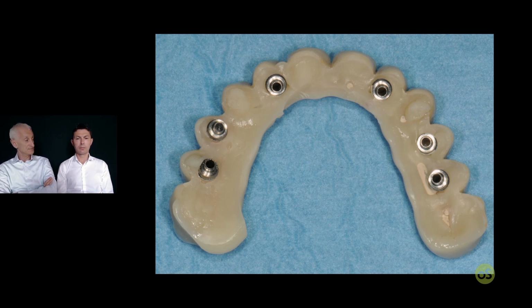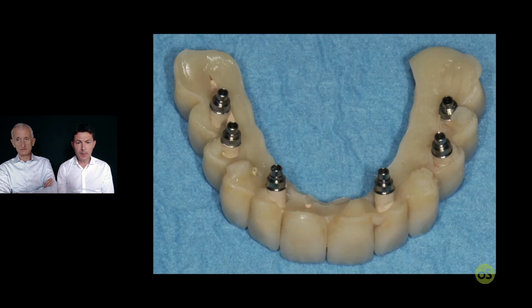Now, extraorally, it's time to fill the gap and add some material to improve the compression, to create the ovate pontic. And it's very important to have a convex restoration.